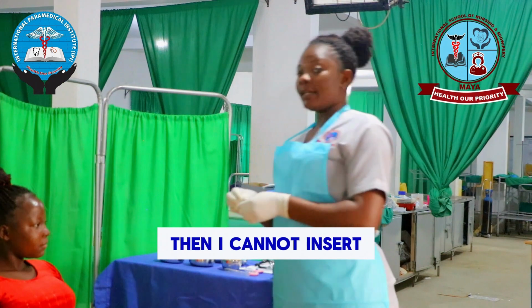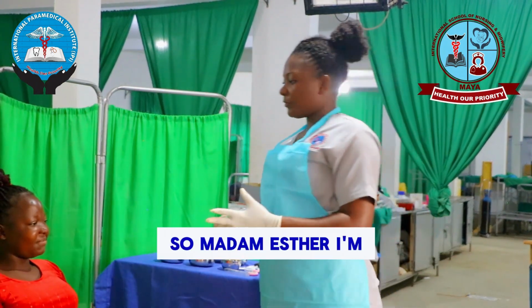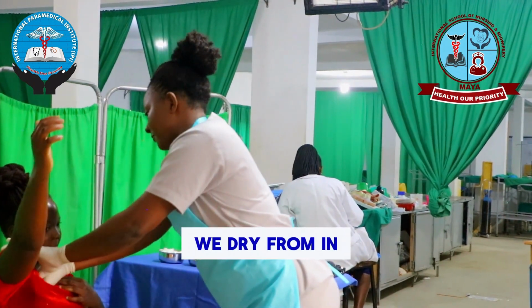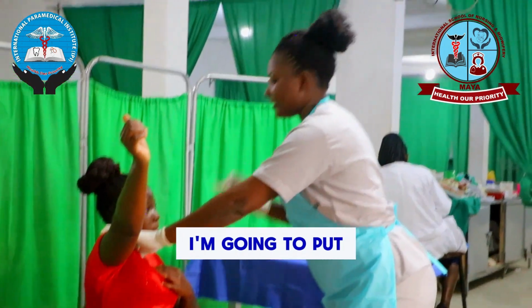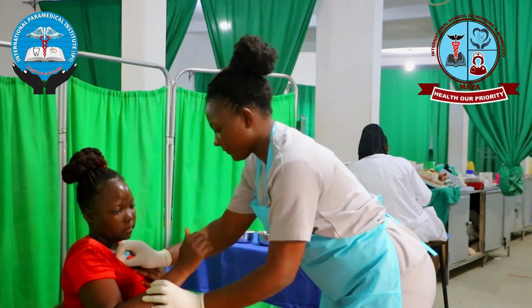Then, I cannot insert my thermometer minus cleaning Madam Esther's armpit. So, Madam Esther, I'm going to dry your armpits. We dry from in, out. Then after drying, I'm going to insert my thermometer like this.